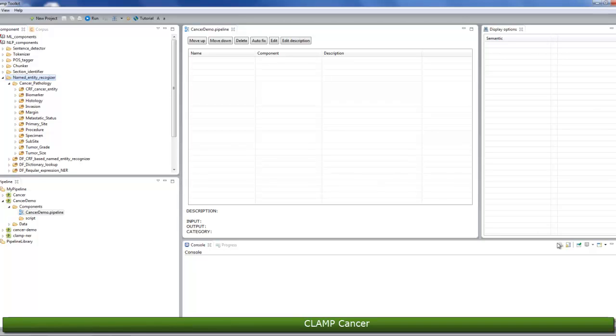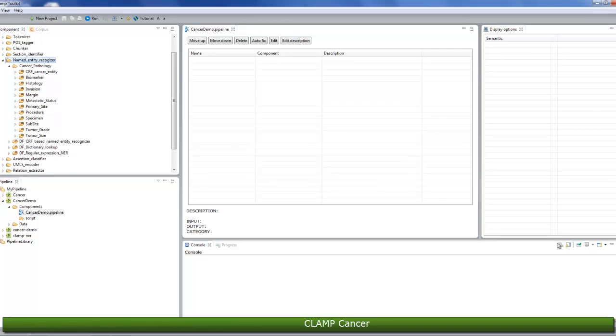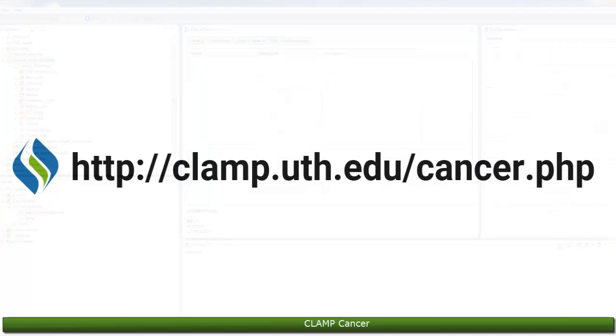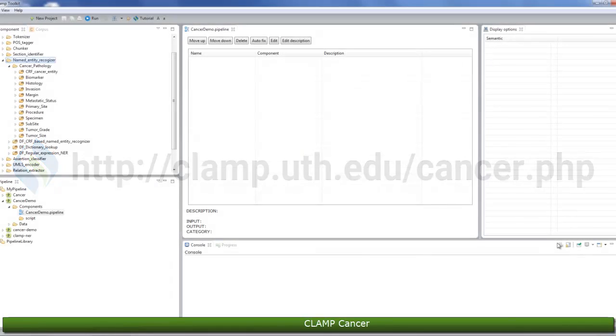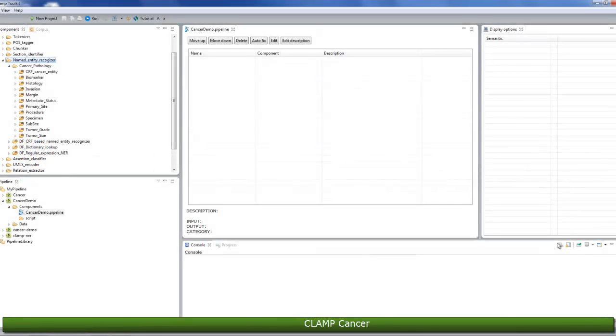You can modify them if you need, or simply use the default settings. For more information, please visit our website at clamp.uth.edu forward slash cancer.php. In this example, we'll use the following components.